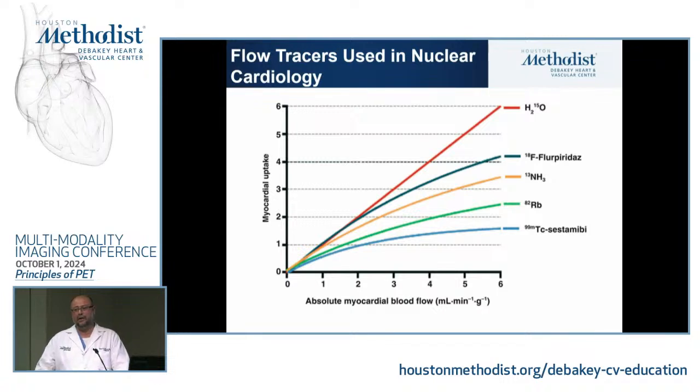And this is why we kind of rely a lot on the 70% data. So with technetium, you're probably going to miss these earlier stenosis, earlier atherosclerotic lesions, but you're only going to detect it when it becomes more stenotic because of the roll-off phenomena. But with O15 water and these more linear tracers, there is a chance that you see it.